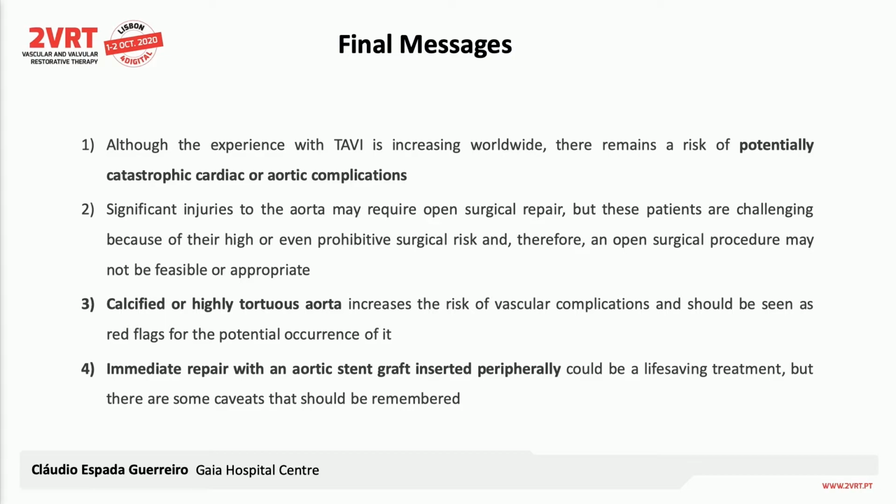As final messages, I would like to stress that although the experience with TAVI is increasing worldwide, there remains a risk of potentially catastrophic cardiac or aortic complications. And significant injuries to the aorta in this context may require open surgical repair, but we have to remember that these patients are challenging. They were challenging in the beginning with very often a prohibitive surgical risk. And in this case, an open surgical procedure to solve the problem could be limited by the LAD graft. In cases with calcified or highly tortuous aorta, we know that there is an increase in the risk of vascular complications, and it should function as a red flag to the potential occurrence of it.